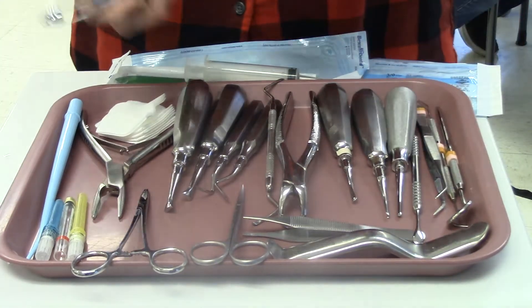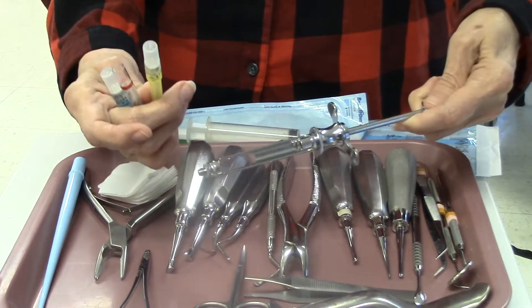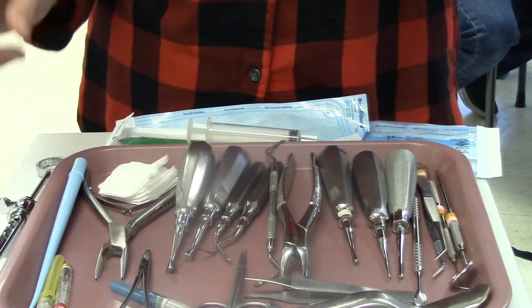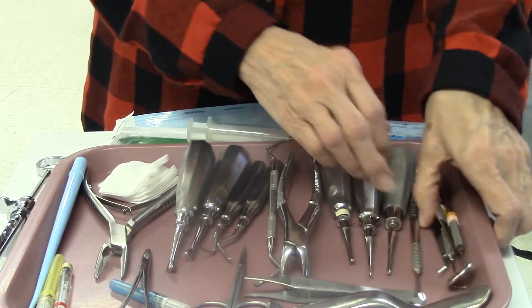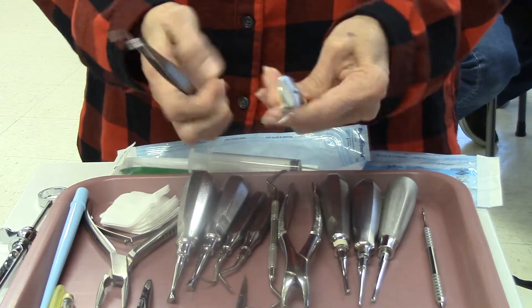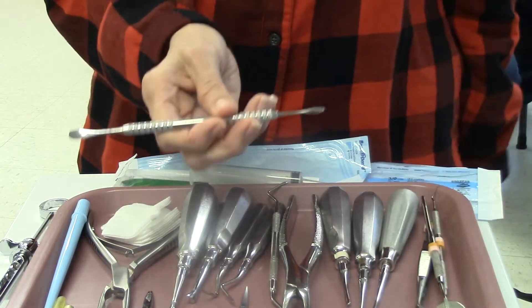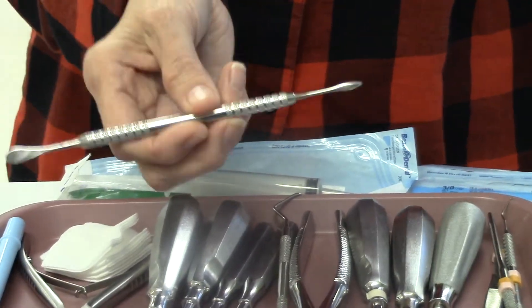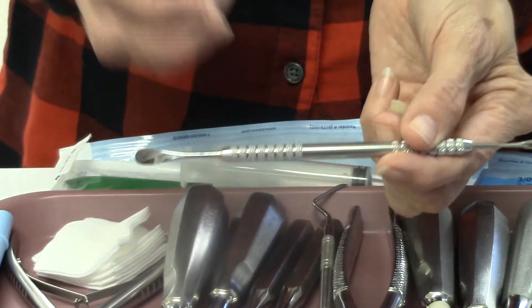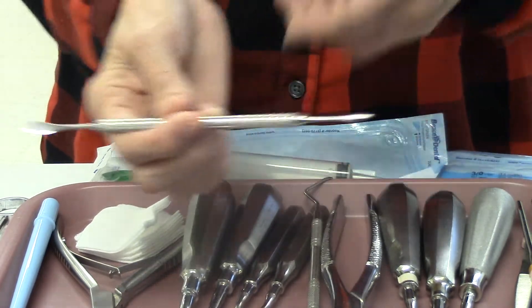We're going to start with our syringe, our needles, our carpal anesthetic, and our topical. Get our patient numb and now we need to go in there. We have our basic setup again which is our mirror, explorer, and cotton pliers. We have our most important instrument, our periosteal elevator, which is used to remove the gum tissue away from the tooth and to break the periodontal ligament.